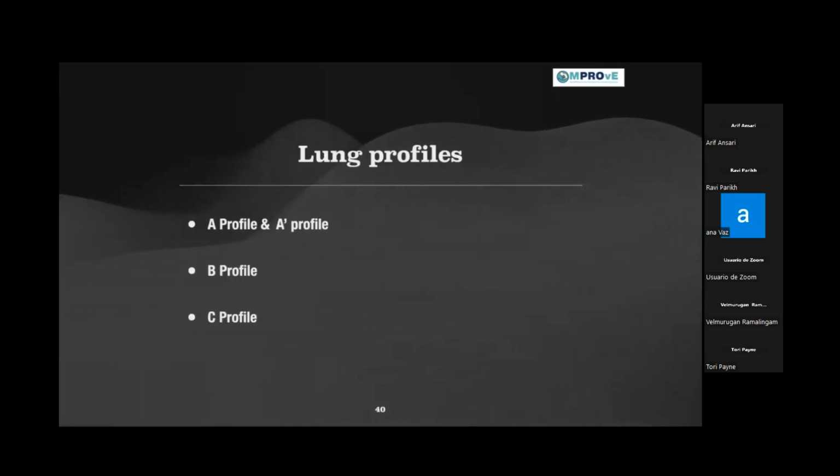And the last thing I wanted to say again is about the ambient light of the room. Do not underestimate that as well. If you are in a well-lit room by the window side and you're trying to scan the baby, your scanner is facing the window and all the reflections are coming from the window. In a bright sunny day, you will struggle to interpret the image, or it will lead to erroneous interpretation.